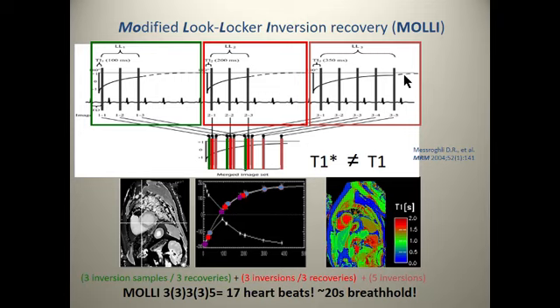So you can see here. So what we can do is we can correct that. There's a well-known correction, which is actually wrong, but everyone uses it, and so we blindly go ahead with it and occasionally put in the odd adjective in our method statement, to demonstrate we're clever, but not clever enough to fix it. So therefore, you can get a T1 map out of this, and this is the sort of thing we're doing all the time.